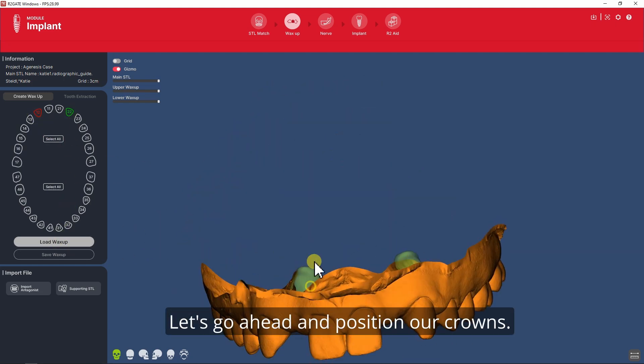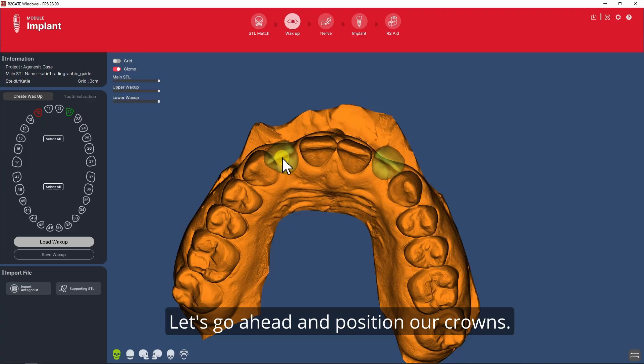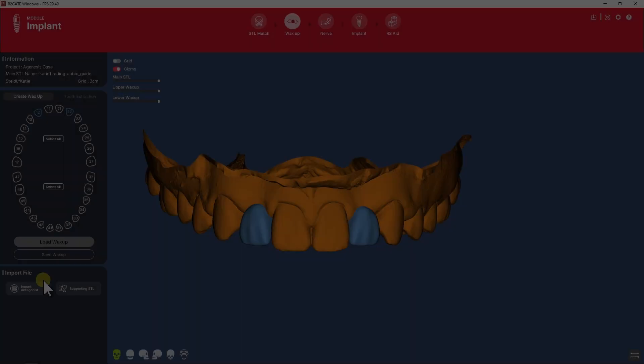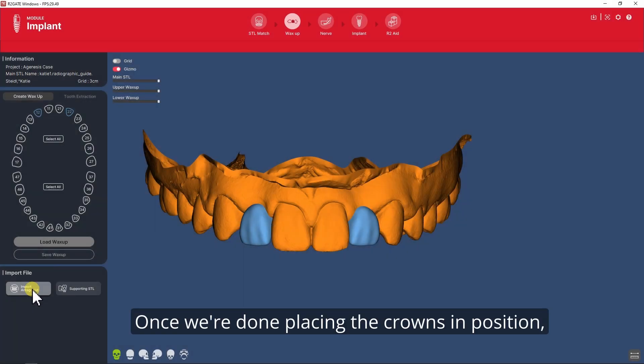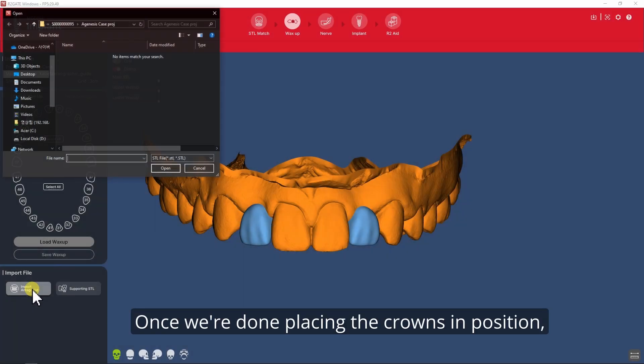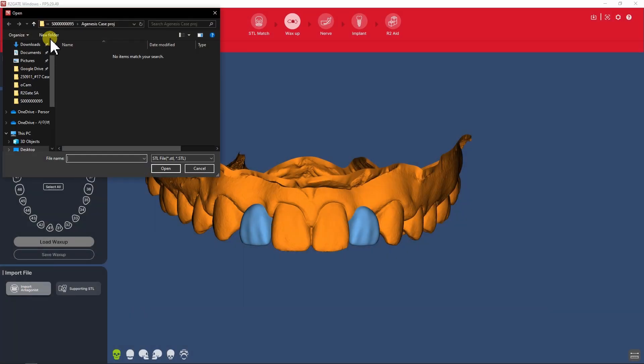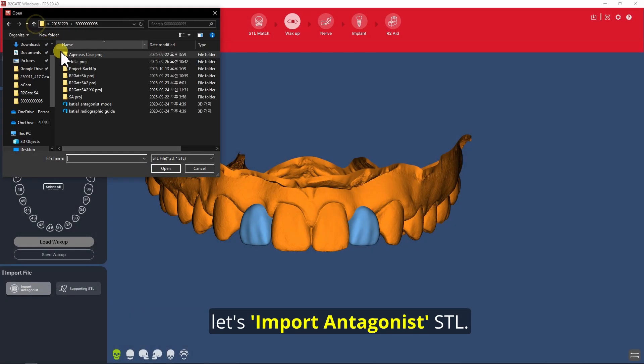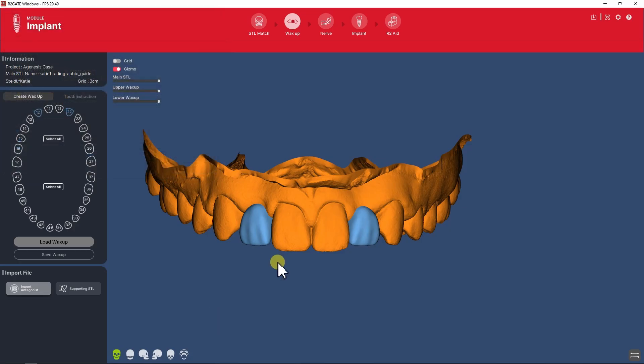Let's go ahead and position our crowns. Once we're done placing the crowns in position, let's import the Antagonist STL.